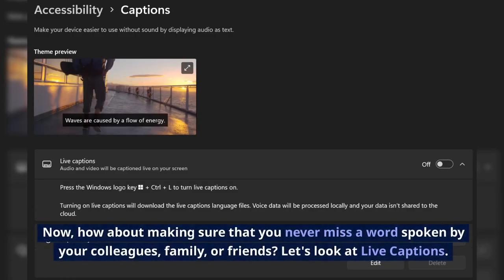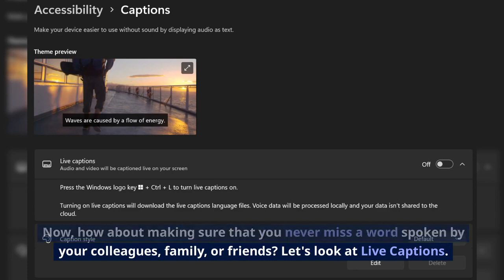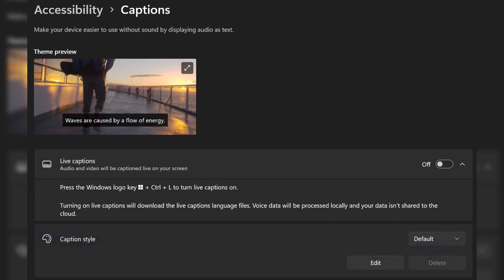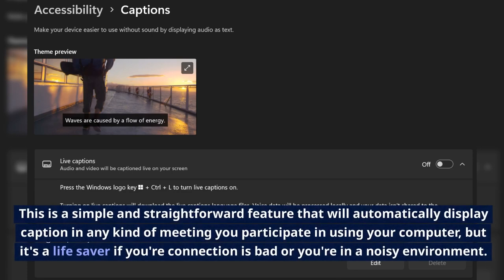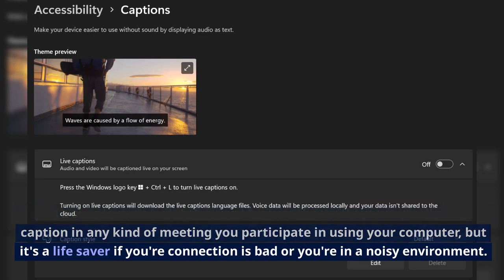Now, how about making sure that you never miss a word spoken by your colleagues, family, or friends? Let's look at Live Captions. This is a simple and straightforward feature that will automatically display caption in any kind of meeting you participate in using your computer, but it's a lifesaver if your connection is bad or you're in a noisy environment.